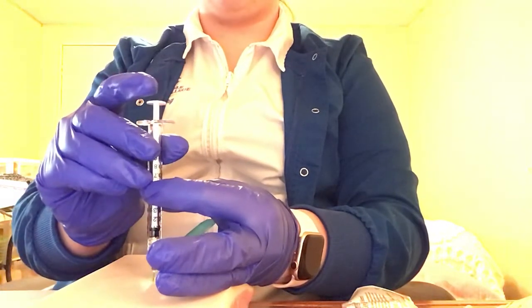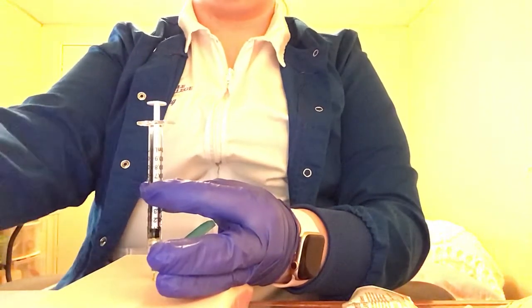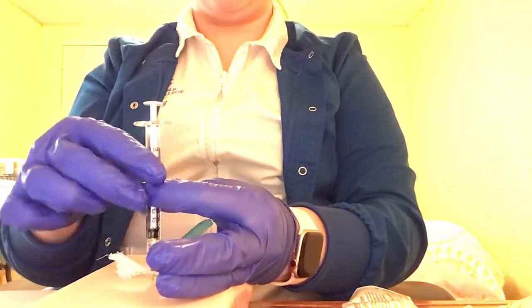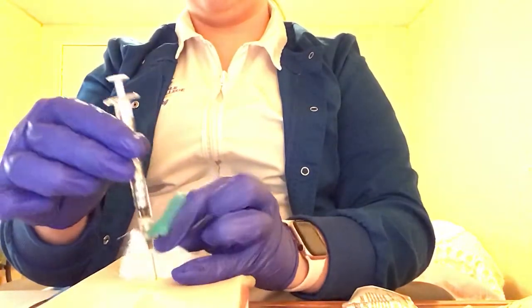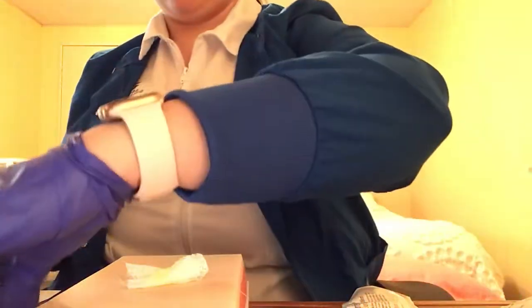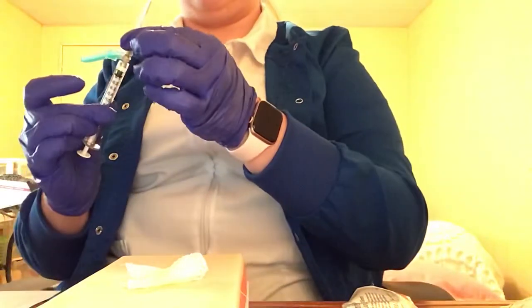And I'm going to stay here for about 5 to 10 seconds. And while I do that, I can grab my gauze to sop up any blood or put any pressure if she is bleeding. And I would put that right here so I can grab it right away. And I would withdraw my needle. And I would just put the gauze there. And then I would go ahead and passively recap my needle. And I would put it in the sharps container.